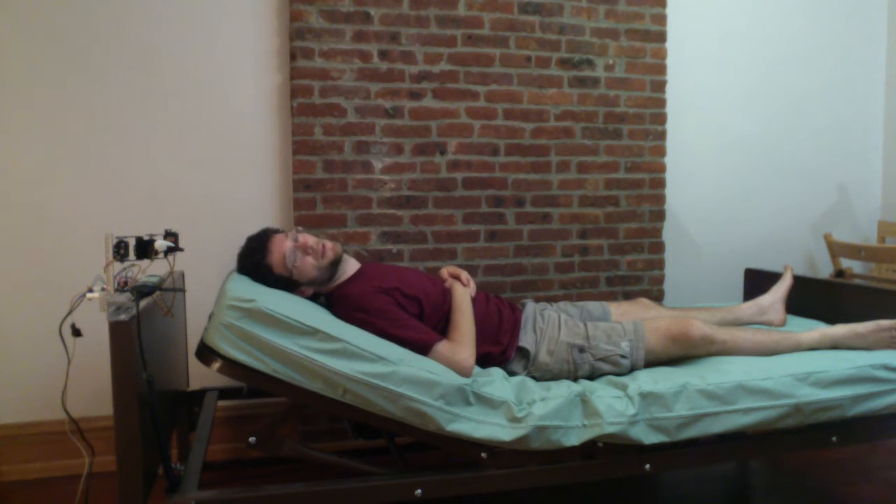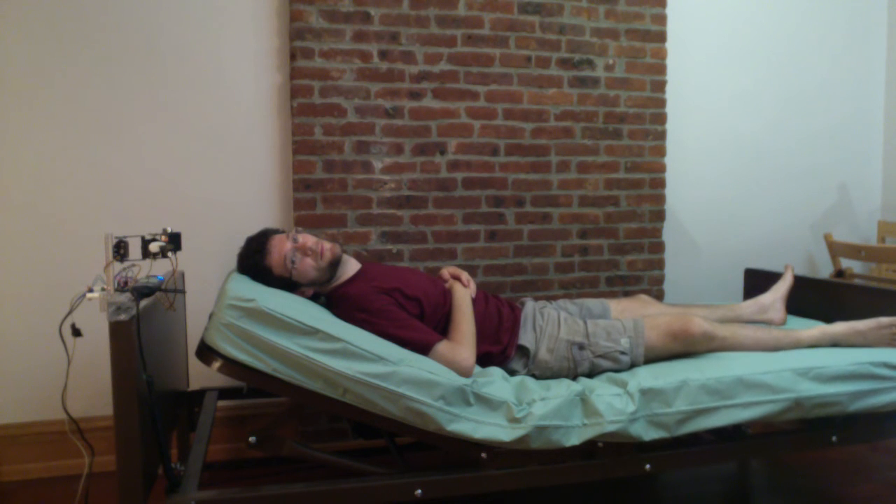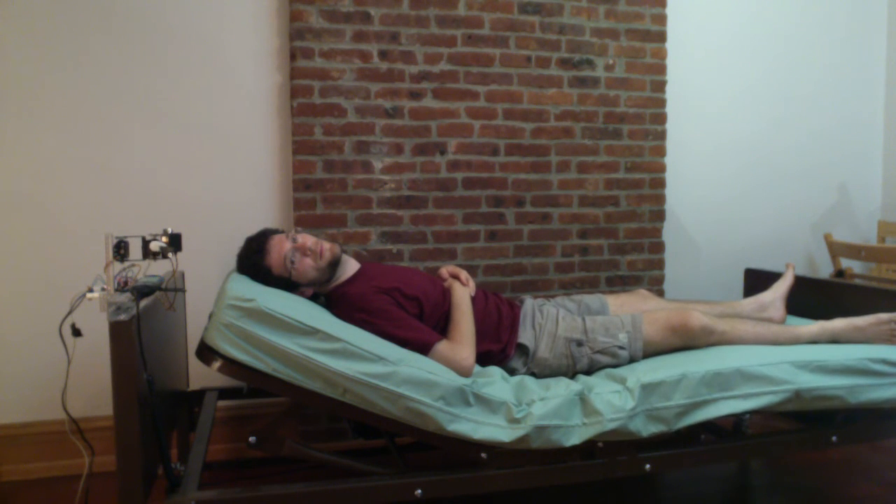Alexa, turn on feet raise four. Okay. Alexa, turn on feet raise four. Okay.